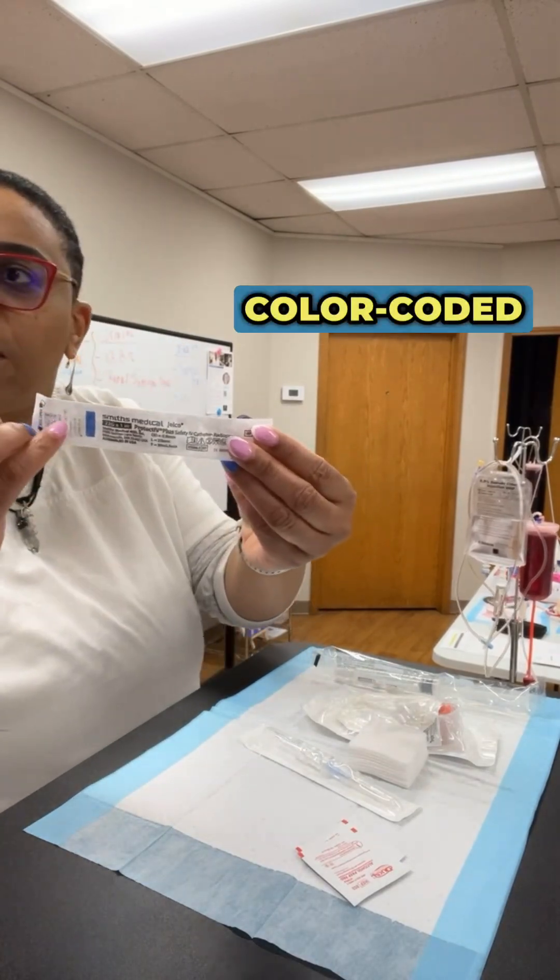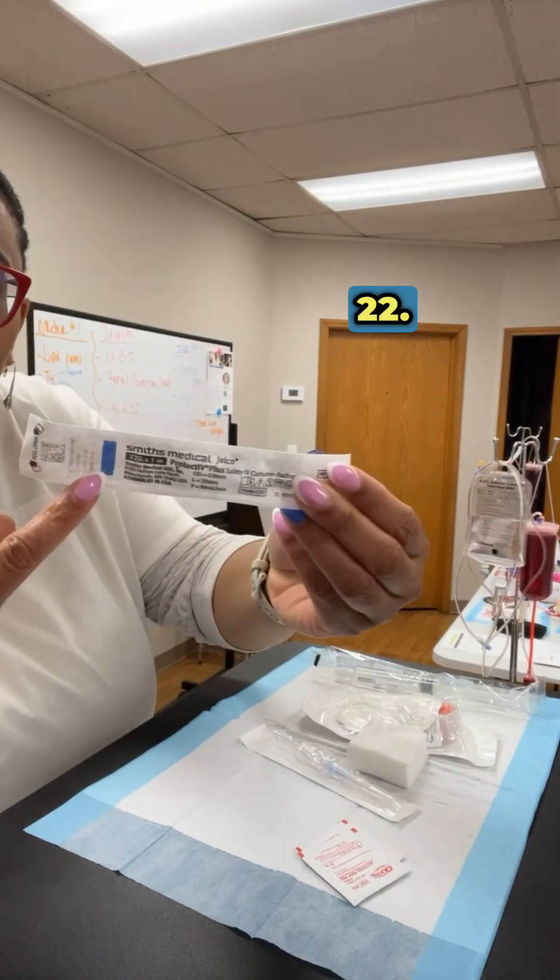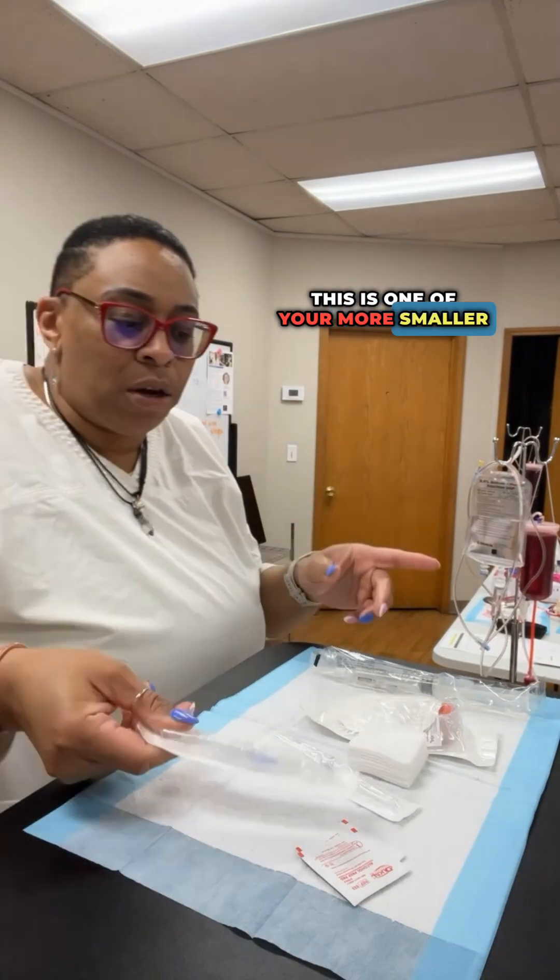This blue one is color-coded blue. This is a 22. This is one of your more smaller IV catheters.